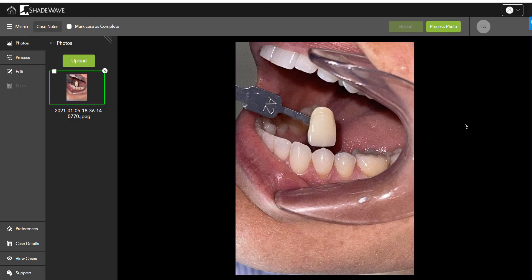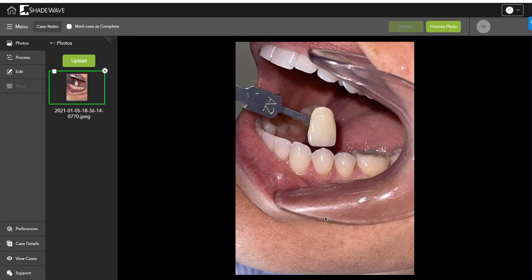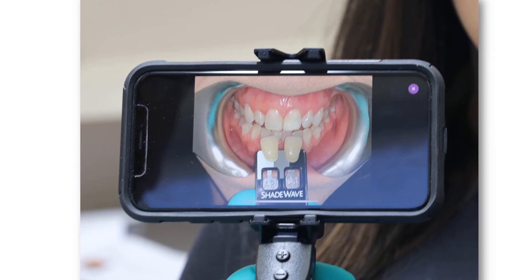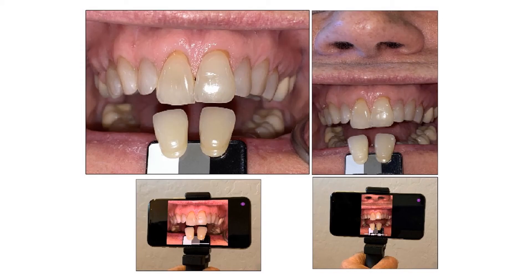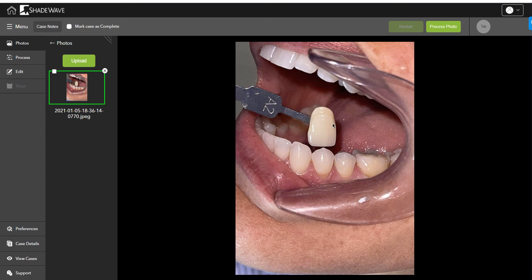I received an email from one of our lab users who says she doesn't get the results from ShadeWave — she feels the shade tab itself is darker than the tooth, and she's confused because the mapping shows the tooth is darker than the shade tab. This was made with ShadeWave mobile from an iPhone. We strongly recommend you hold the iPhone horizontally, not vertically, because of the magnification you get. This is actually an illusion because the tooth is very translucent.